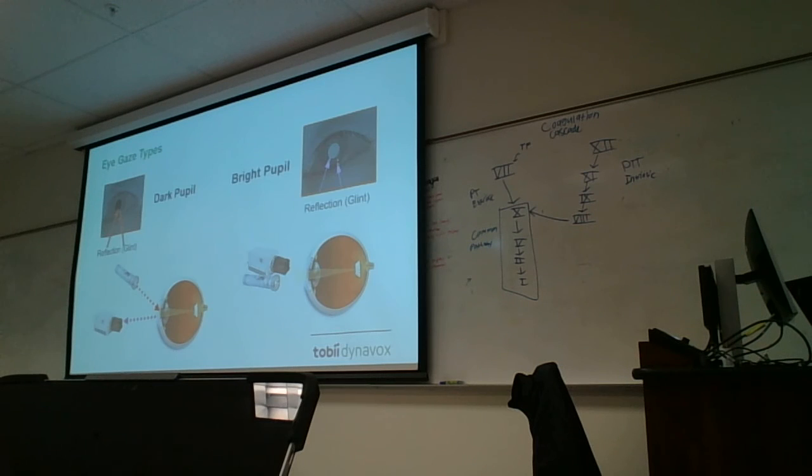So let's skip this. It just talks about what happens when the eye tracker takes measurements, and you'll be able to do that once we get onto the device. And you follow along with the gaze interaction and the eye gaze settings.